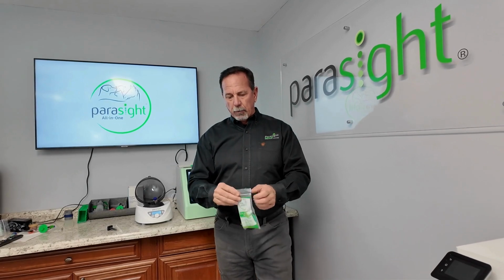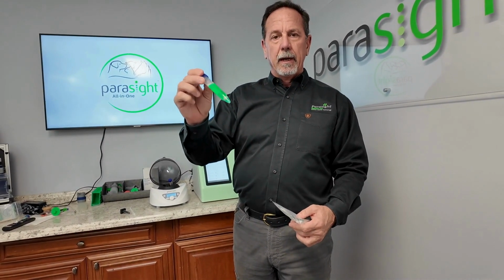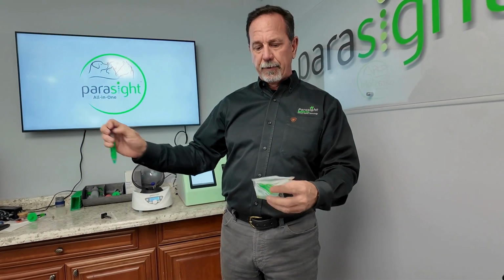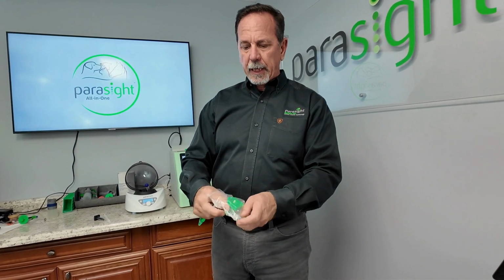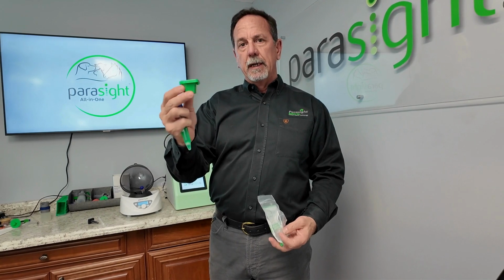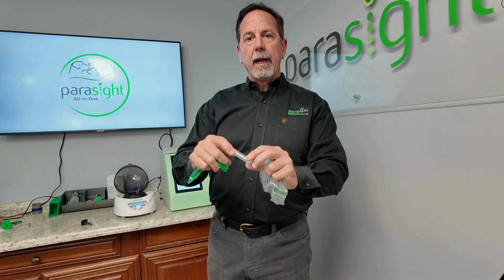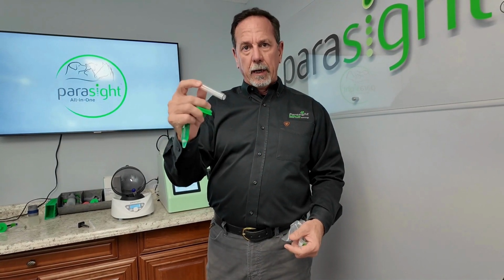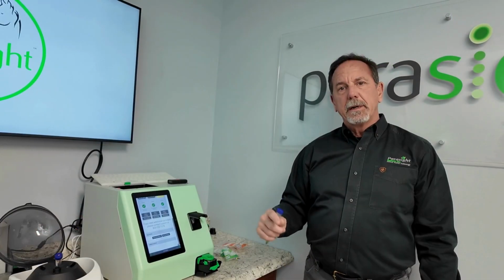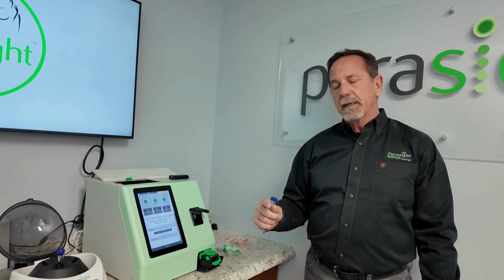package. What you'll first have is a vial full of fecal med, colored fecal med. This will allow the eggs to travel to the top after being centrifuged. You'll have a specimen chamber. They may be different colors. It just reminds you of which type of test you're running. And very importantly, there'll be an egg separator as well, and this is going to be key to having a successful test. When experiencing a clogged specimen chamber, it may look something like this.